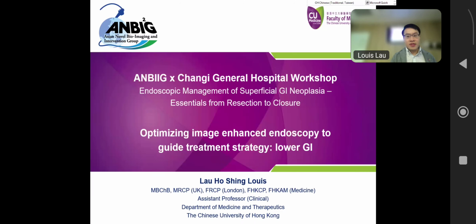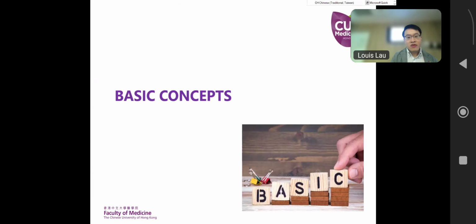So my talk today will be covering the image enhanced endoscopy in the lower GI tract. I'm Louis Lau from CHK. So my disclaimers. I would like to start with some basic concepts about the image enhanced endoscopy and also how we approach the diagnosis.